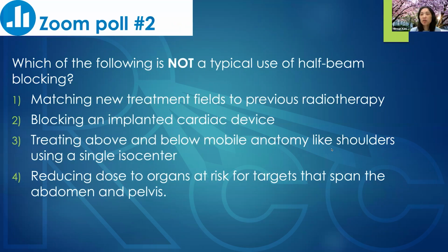So Dustin, there is a question from the audience. Can changing the collimator angle modify dose modulation? Certainly changing a collimator angle in palliative radiotherapy can do a few things. When we're doing palliative radiotherapy, we don't talk a lot about modulation.